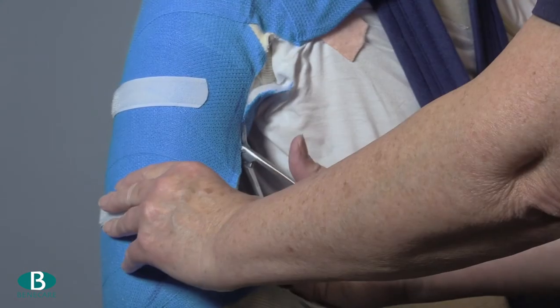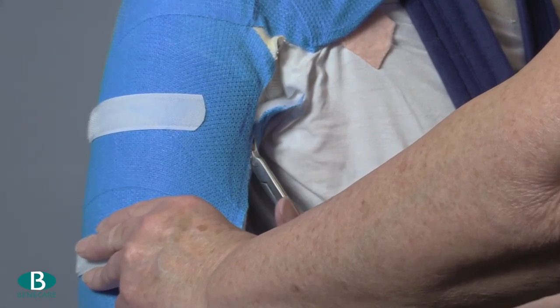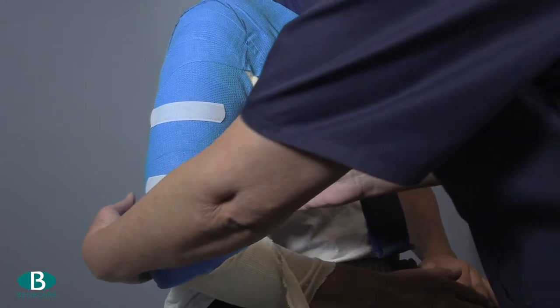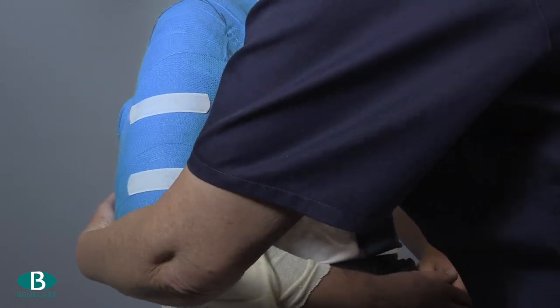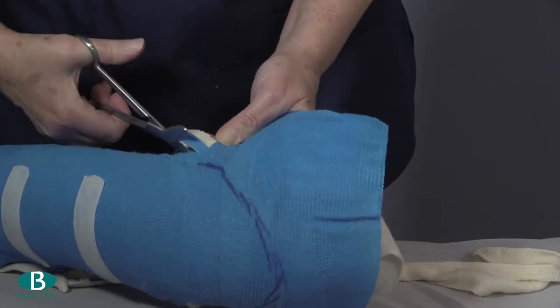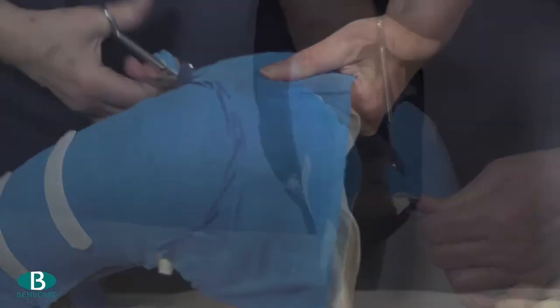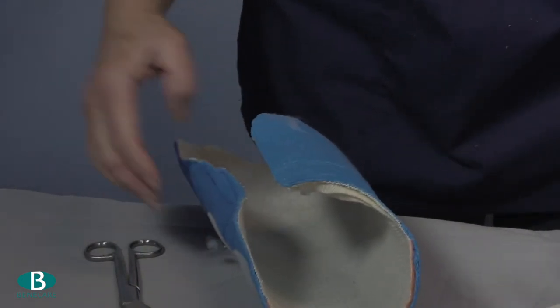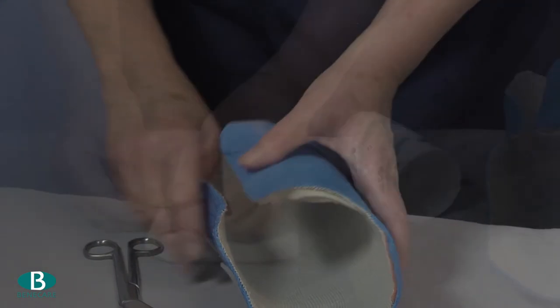Remove the cast by cutting along the anterior border using scissors and nibblers if required to prevent pressure on the limb. Remove the cast carefully from the limb and trim following the template previously drawn, and also cut a thin strip out approximately one centimetre along the opening of the brace.